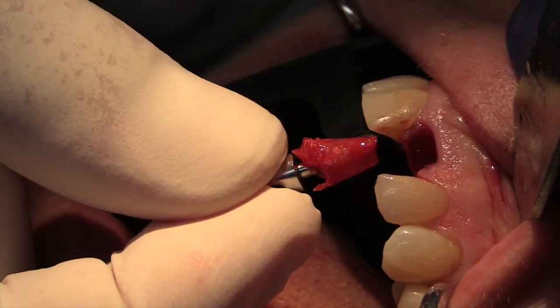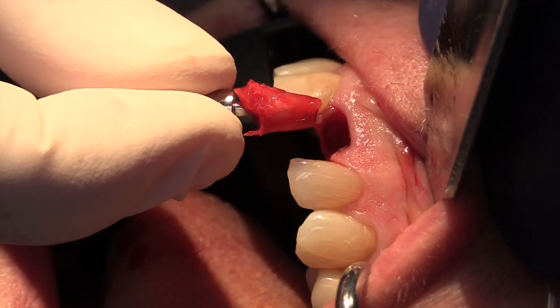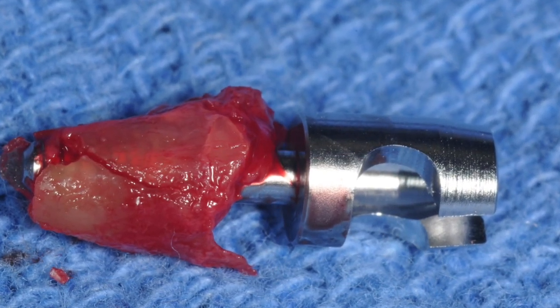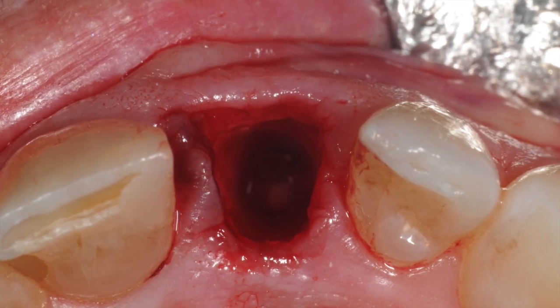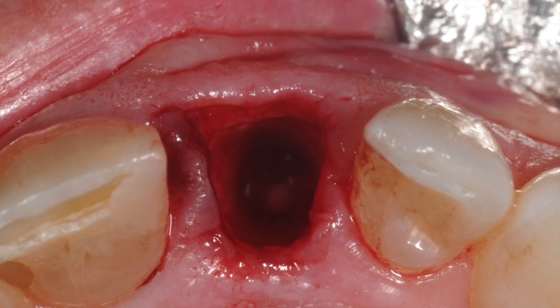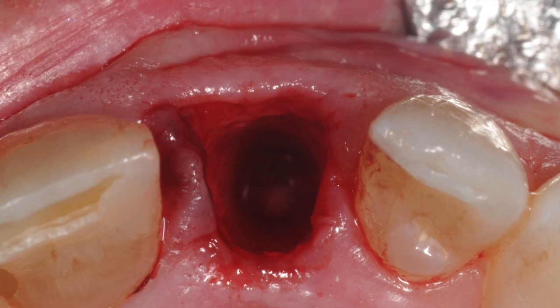Often, a popping sound is heard as the root emerges out of the socket. And here is the root with the retaining pin in place. And here is the socket with the intact buccal plate bone and soft tissue. The site can be gently curetted and is now ready for immediate implant placement if planned.